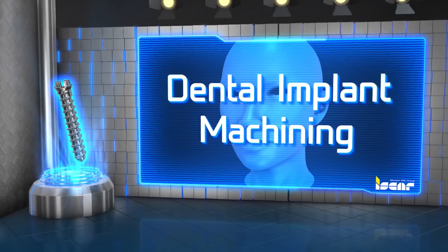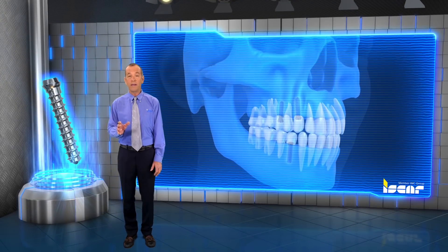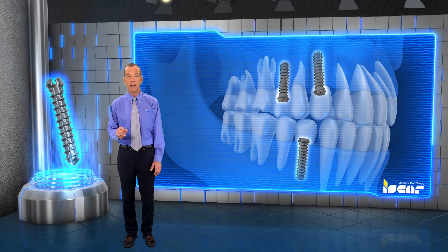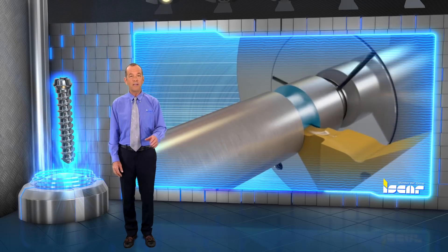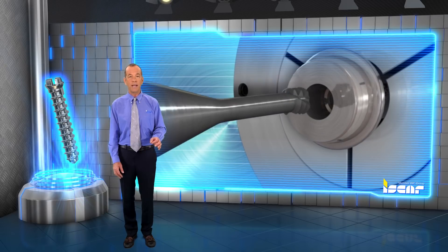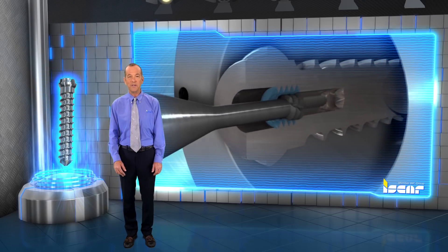Dental Implant Machining. ISCAR offers unique high-quality cutting tools and innovative solutions for advanced small parts machining as well as enhanced Swiss type machine processes for the miniature market. ISCAR introduces a complete machining process for dental screws and implants on Swiss type machines. Let's take an in-depth look at these new tools.